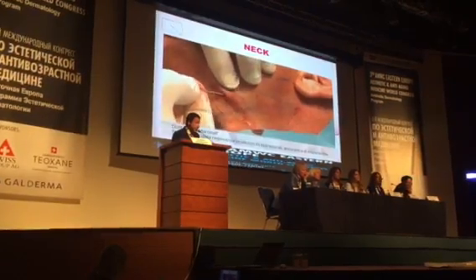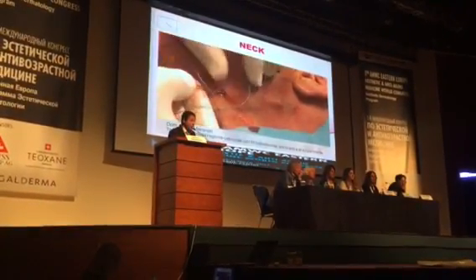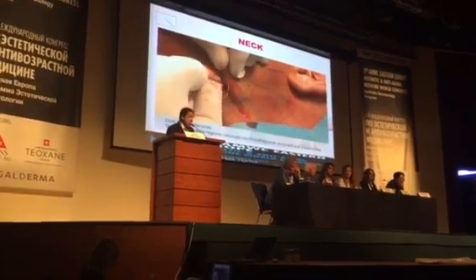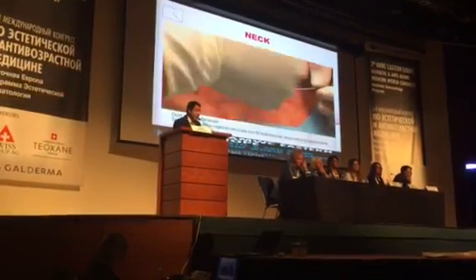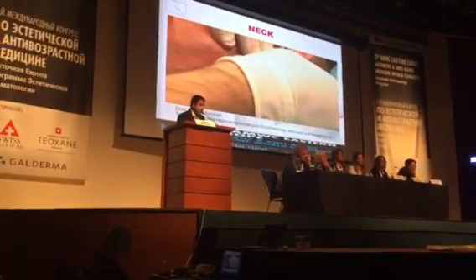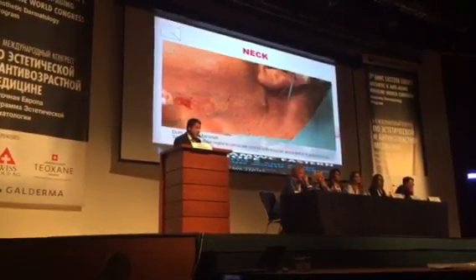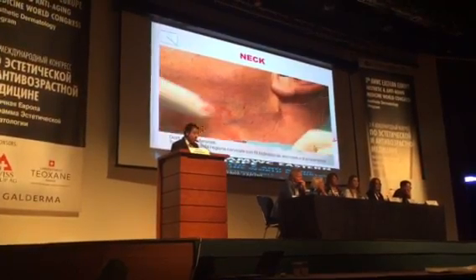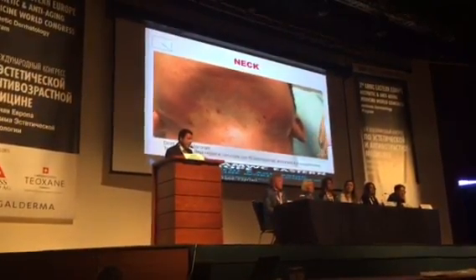In this technique, usually I use 4 threads to treat all the region. With 2 threads, I start, for example, above the left ear and I exit on the right side. And with the other 2 threads, I make the opposite. I start above the right ear and I exit on the left side.